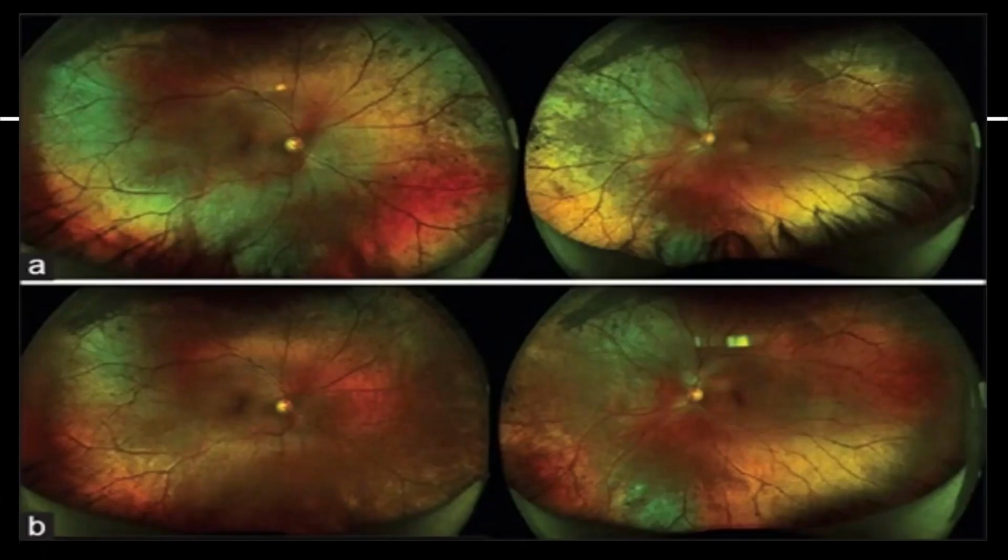So diagnosis again. These are all very classic examples that I'm showing you. So what is there in the first picture? This is an Optos picture. What is there in the first image? Is there any difference between these two images? Okay, I'll give you one clue. Before and after dark adaptation. Oguchi disease showing the Mizuo-Nakamura phenomenon, classic Nakamura phenomenon.